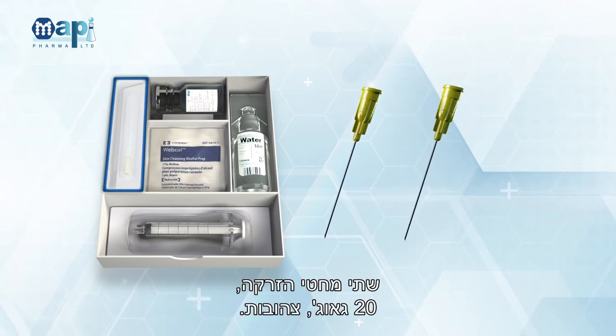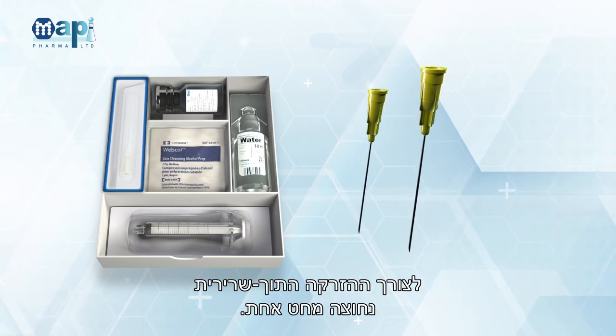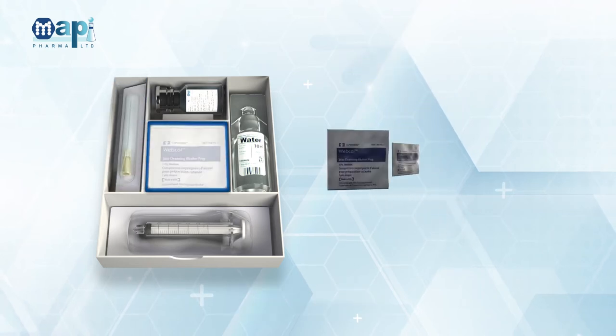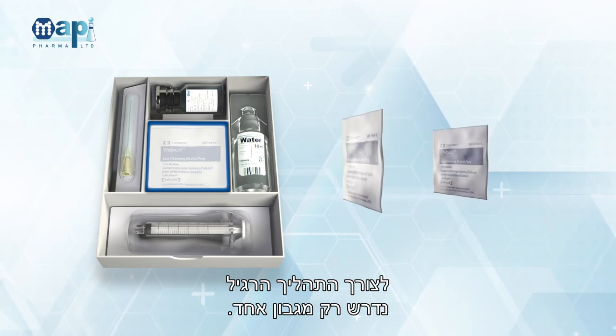2 Injection Needles, 20 Gauge, Yellow. 1 of the 20 Gauge Needles is needed for the intramuscular injection; the other 20 Gauge Needle is a spare needle. 2 Alcohol Swabs — only 1 alcohol swab is needed for the usual process.